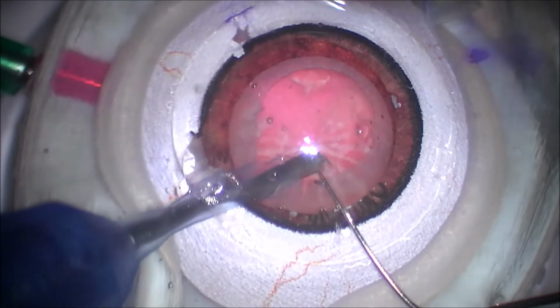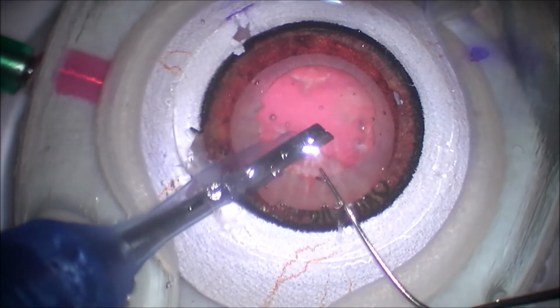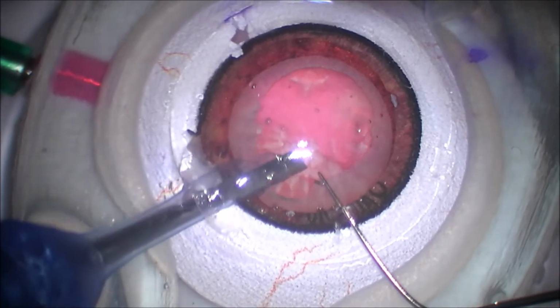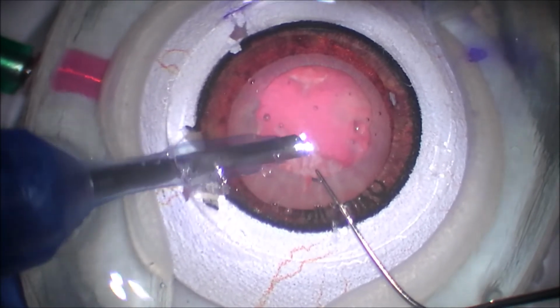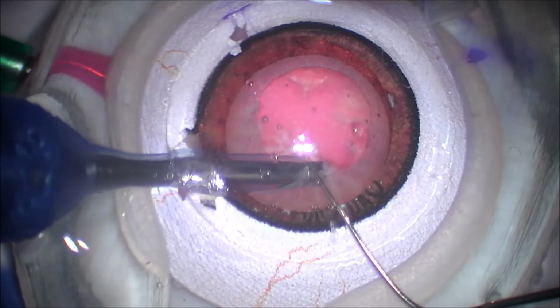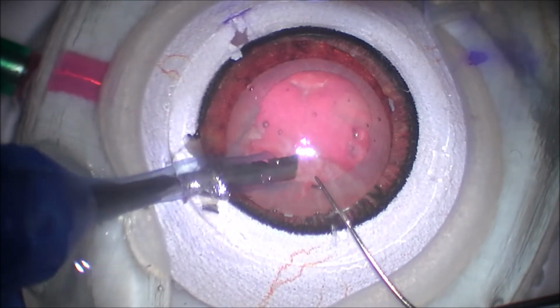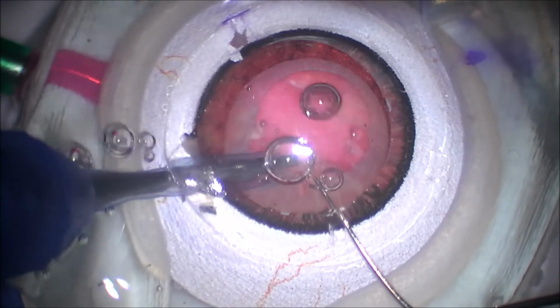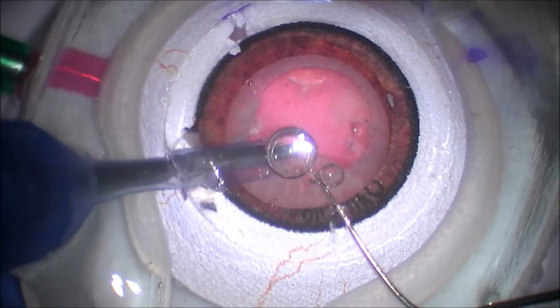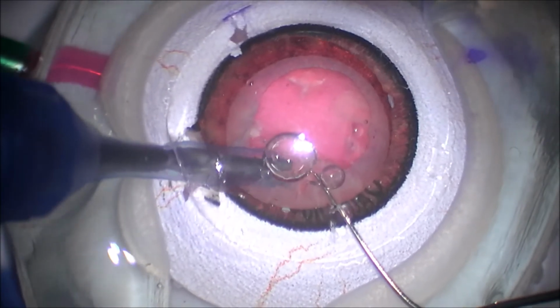And now she's got a pretty big piece sub-incisionally, and she's trying to figure out how she's going to get to those pieces. Of course, the best thing to do in this case is, if you can, hydrodissect once again. But of course, in this case, it's not really a real eye. It might not work. So then you can use your second instrument to try to pull the pieces up out of the bag. And so that's one thing that I would consider doing. But again, that's kind of a higher level technique.